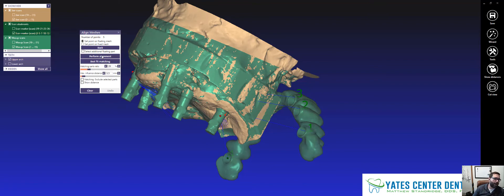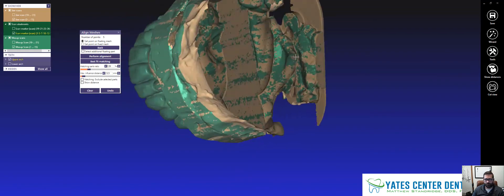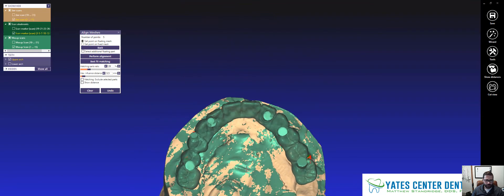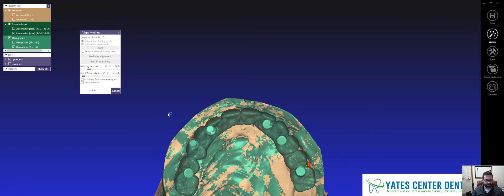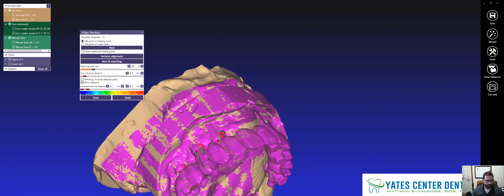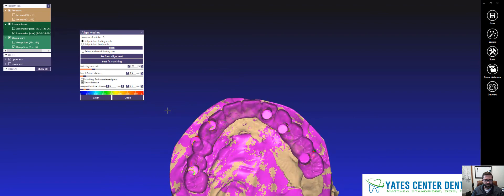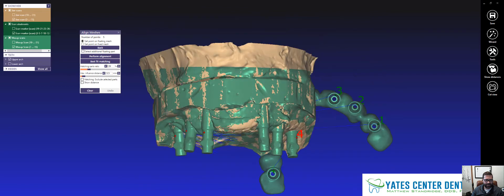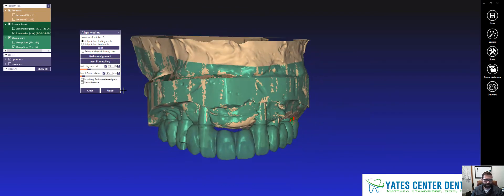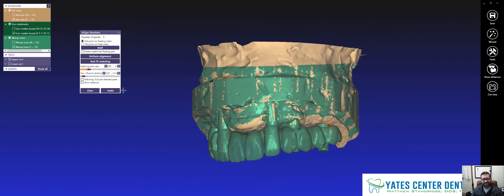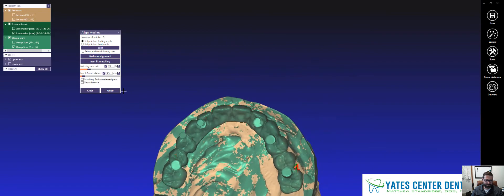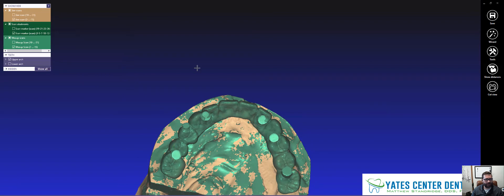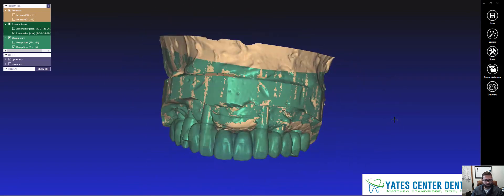Now this is just for a wax up, so it's not having to be, you know, as they say in My Cousin Vinny, dead-on balls accurate. But if you see here and you look from the top here, I'm going to try best fit matching. Sometimes that actually can screw things up a bit. Yeah, I actually don't like that. So I'm just going to hit perform alignment. I'm not going to do best fit matching. Best fit matching is kind of wishy-washy on doing inverted scans. I actually just like the original one better. And so now I have that upper related.